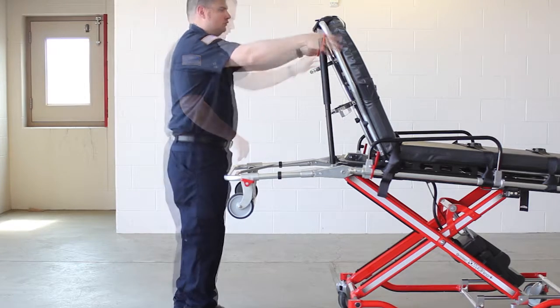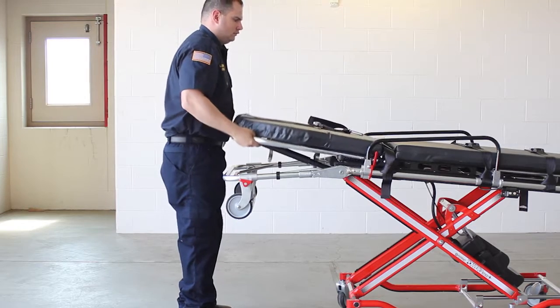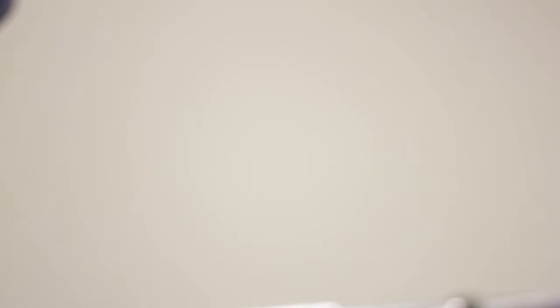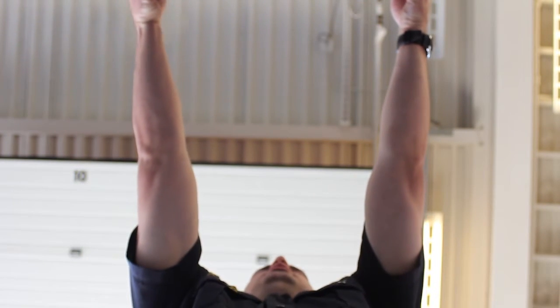The backrest movement is controlled. The gas spring is under pressure to ease raising and lowering. When a heavy patient is on the cot, support the patient's weight before adjusting the backrest. When a light patient is on the cot, control the upward movement of the backrest so it does not move too quickly.